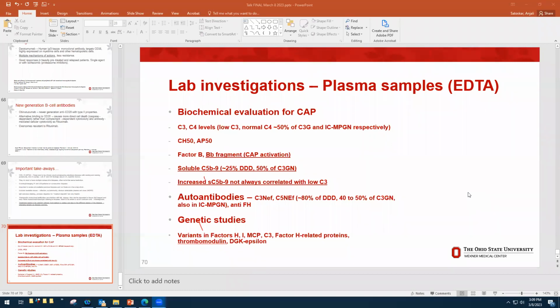Is it really the monoclonality or the C3? Yeah, and I showed you that case number 2, remember, with the eculizumab staining coming up in the biopsy. That patient also had bright C3, but also had this IgG lambda, very similar to this case. But that case was labeled as C3GN, maybe because it was an 8-year-old patient, and the C3 was more than 2 orders of magnitude higher. It just highlights the subjectivity that exists even in the diagnostic angle that we give it. Okay, we have a question.